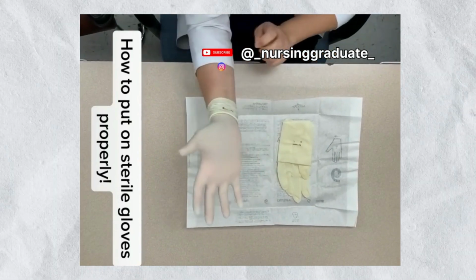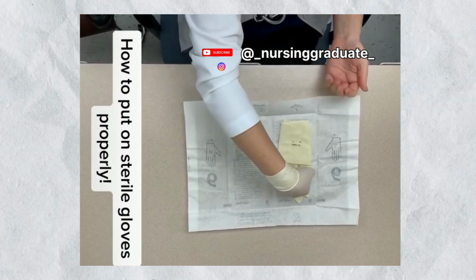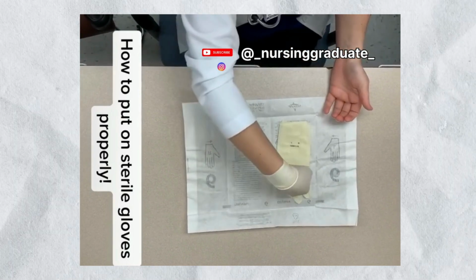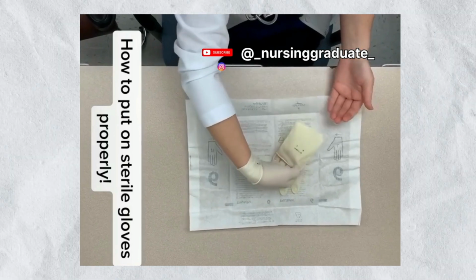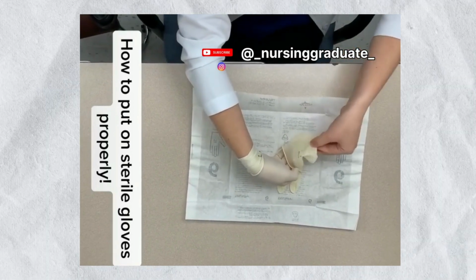So it's in. And it's okay if your fingers don't go into the holes, right? That's okay. Now you go in through, so your fingers in right here, and you grab it like this, right? So then here, you can touch the outside. So go in, same thing.